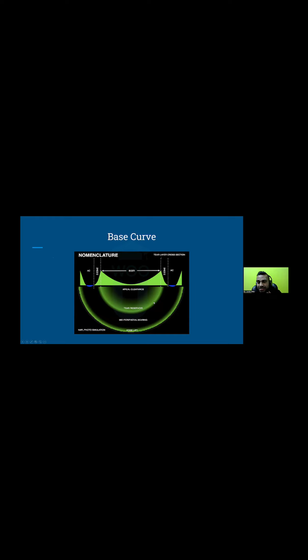If you look at this image, it shows a tear layer profile underneath with a fluorescein image of how the Ortho-k retainer would look at a slit lamp. Centrally you see this area of black that looks like bearing. And I say it looks like bearing because we're not actually compressing the cornea at all. We have a little bit of lift. You just can't visualize it because of the molecular weight of fluorescein. The molecular weight of fluorescein is about 20 to 25 microns, so if you have anything less than that, you won't be able to visualize it. We aim for about 5, 10, or 20 microns in an Ortho-k design, so you're not going to appreciate that at the slit lamp. It'll look like bearing, but it's not true bearing.